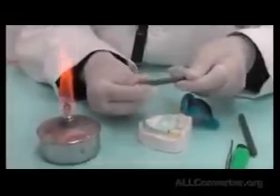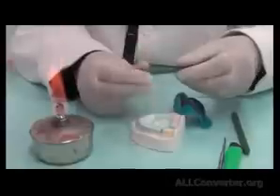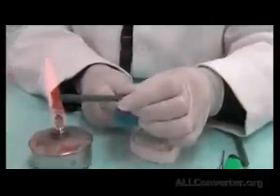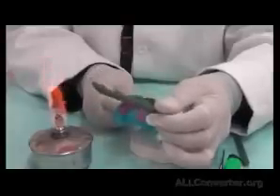So I'm tempering the green stick. I could cool it down, gather the material all together, because it will flow and drip. I want to just gather it and heat it as gathered material. I put it into flame once more and see how it's now flowing.